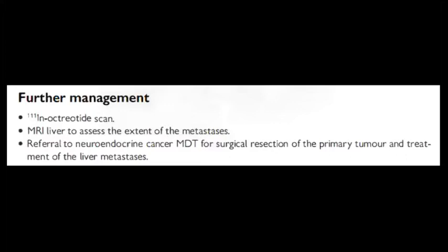So I will just write in the chat. Maybe you can recognize it: PET CT gallium scan. What will it show you, is it positive or negative? The question is, will it be positive for carcinoid or negative in this case? It will be very positive, not just positive, very high positive. So for the neuroendocrine tumor, the gallium is very high positive. It will be very high uptake, okay?